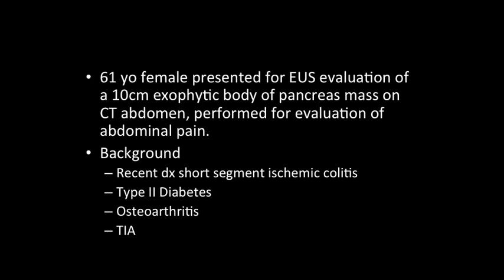A 61-year-old female presented for EUS evaluation of a 10 cm exophytic body of pancreas mass on CT abdomen, performed for evaluation of abdominal pain. She had a recent history of short segment ischemic colitis and a background of type 2 diabetes mellitus, osteoarthritis, and previous transient ischemic attack.